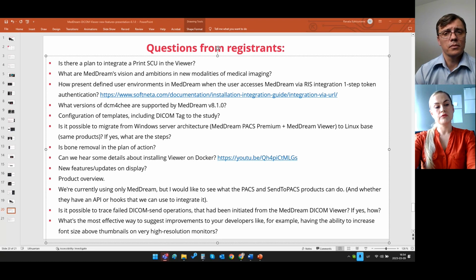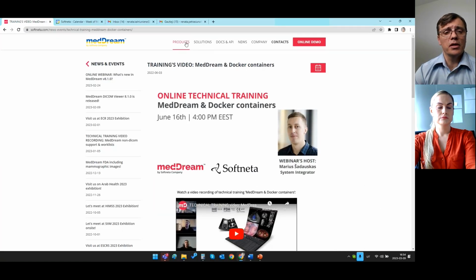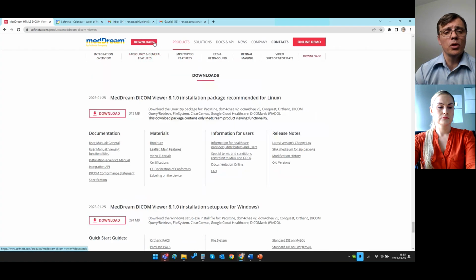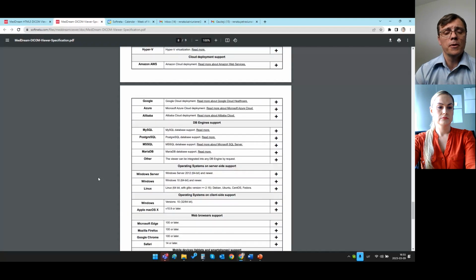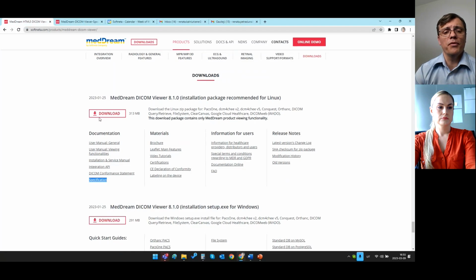Another one, product overview. Yes, product overview. Renata, maybe you can go to our website and show. Everyone needs to know that Renata does huge work creating a specification for the product overview each time. In any of our products, if you go to the download section, you can find the specification. If you click specification, you automatically get a document with a summary of all functions of that product. It's just 5 minutes, no overhead, and you can know all the features in the product. And this is applicable for all our products.